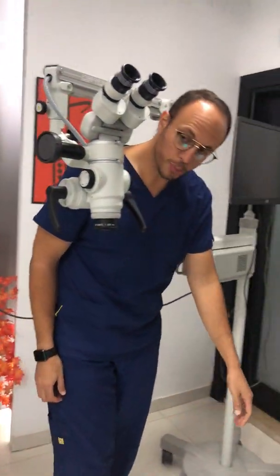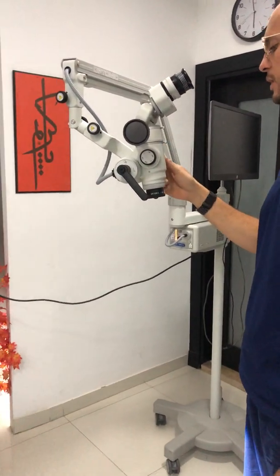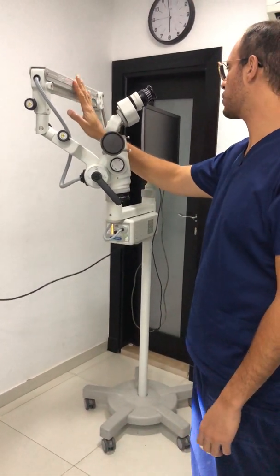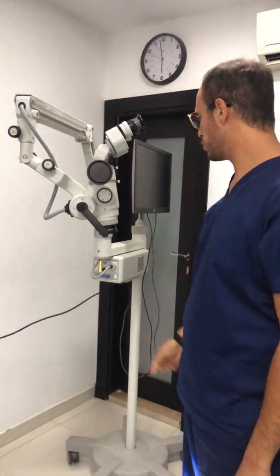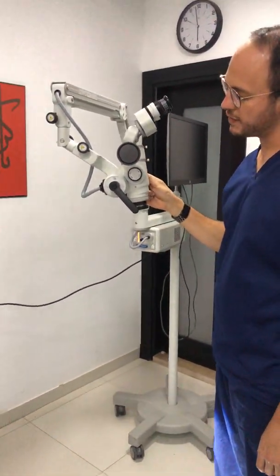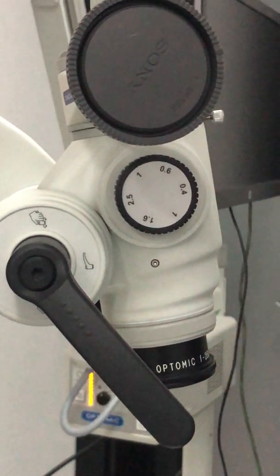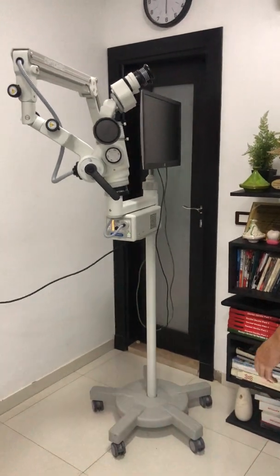The good aspect about this microscope is that it feels well built — you can feel the European finish. Everything is well polished, all metal, and even the transition of the lens itself sounds and feels very accurate.